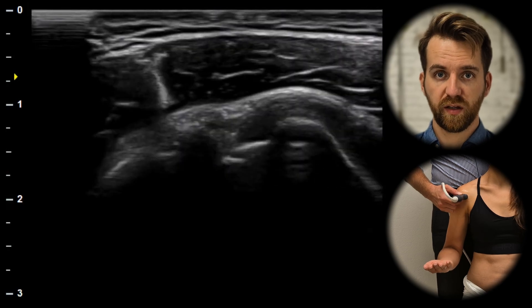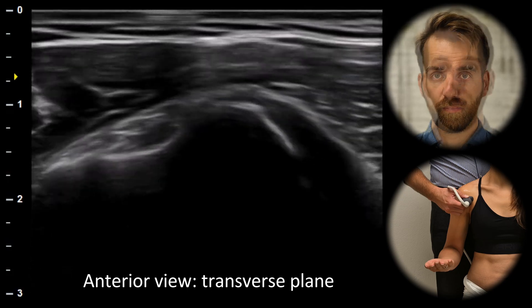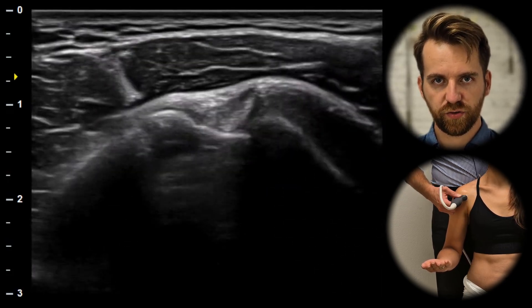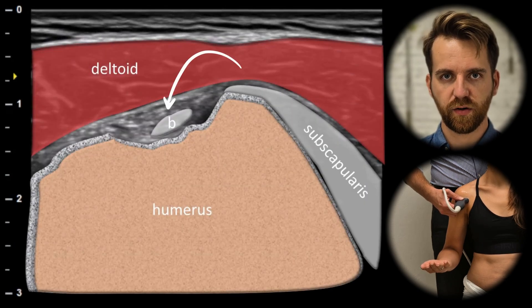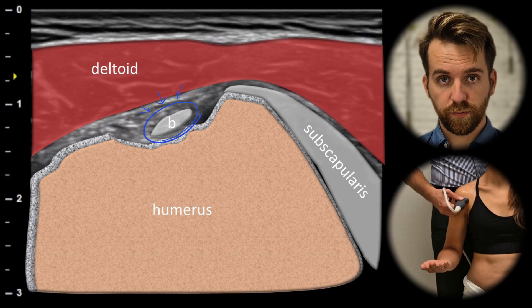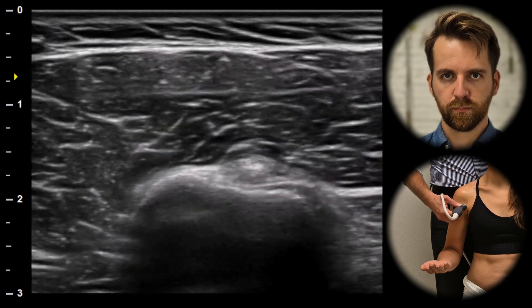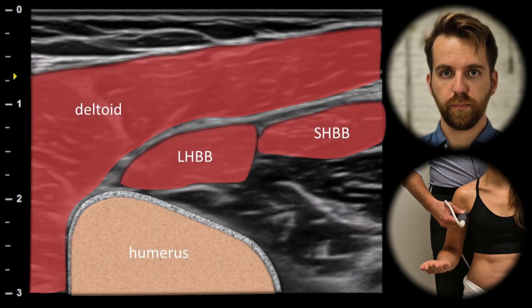The examination begins with the anterior view in the transverse plane. Medially we can see the subscapularis tendon and its insertion at the lesser tubercle. Laterally we can see the tendon of the long head of biceps in the bicipital groove. This is the first place to look for joint fluid as it is the lowest part of the joint. We can follow the tendon distally to its insertion to the muscle belly.